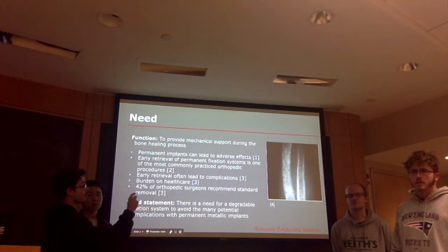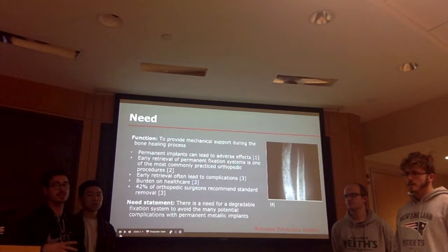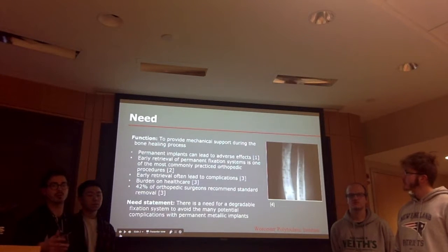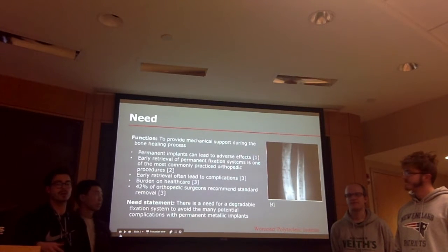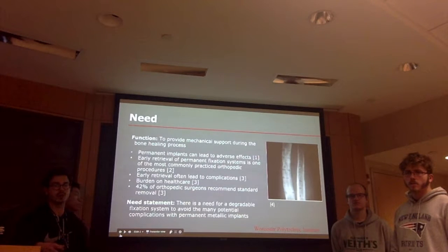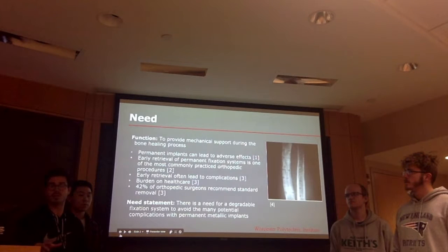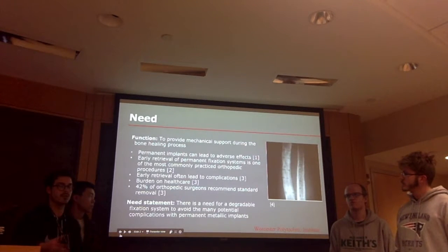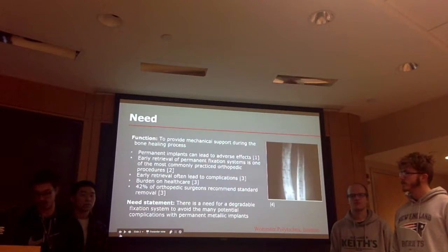Notice that the areas of bone around the screw insertion sites are less dense. So because of these issues, a lot of these implants require secondary removal surgeries, which is one of the most commonly performed orthopedic surgeries today. 42% of orthopedic surgeons recommend the standard removal of internal fixation systems, despite the risk and the cost associated with these procedures. And so this really highlights a need for a biodegradable internal fixation system that can avoid the adverse effects of permanent metallic implants while preventing the need for any sort of secondary surgeries.